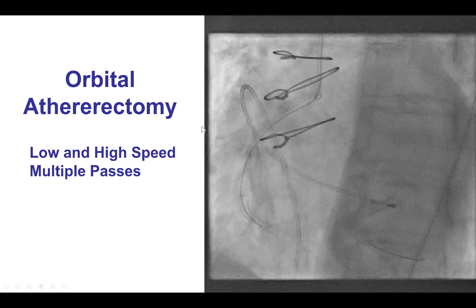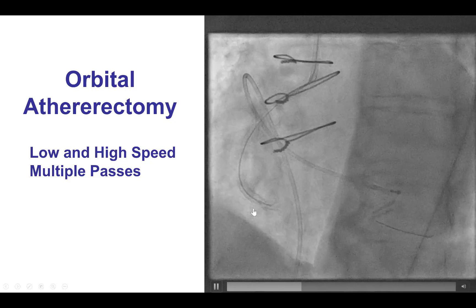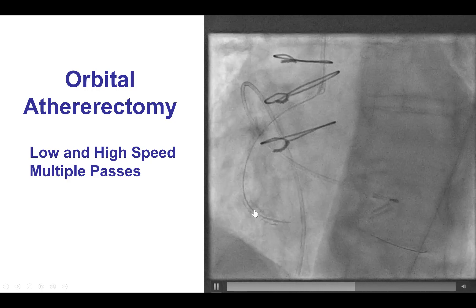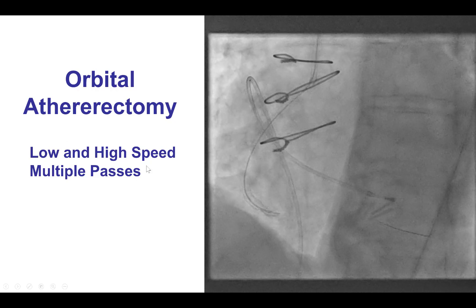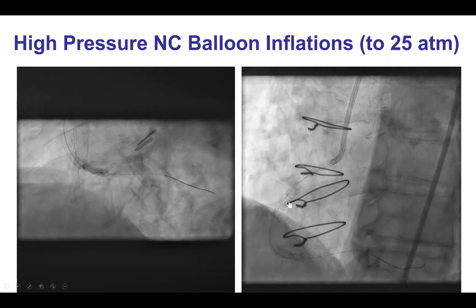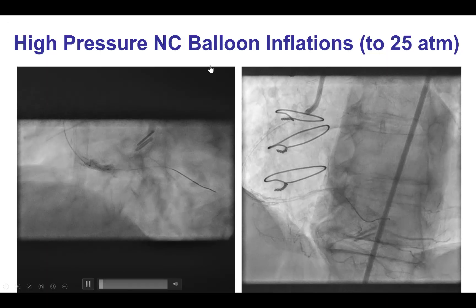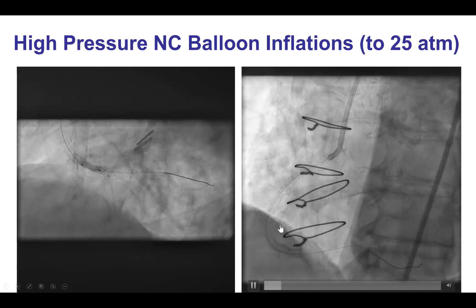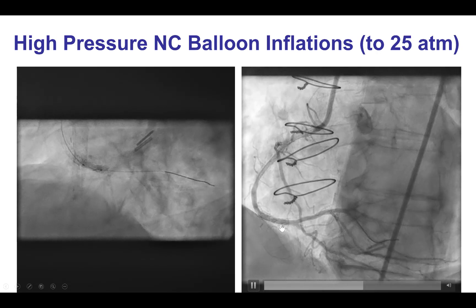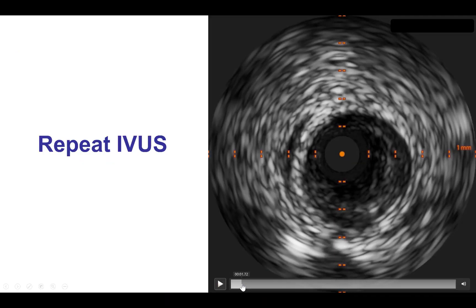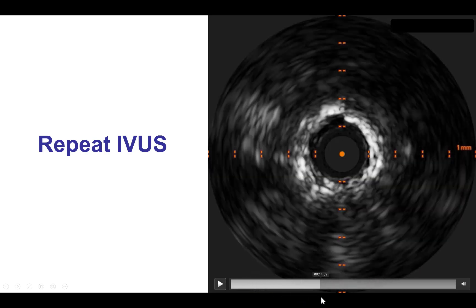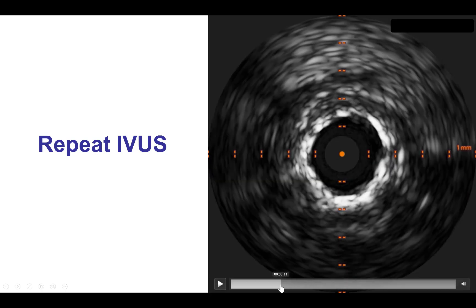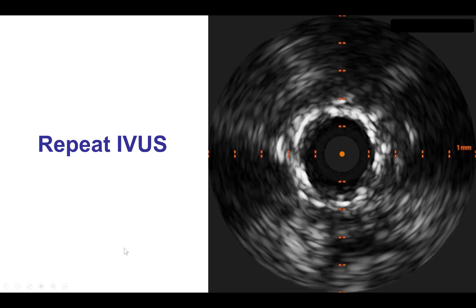A recent paper by Carl Alasved has shown that orbital atherectomy can be useful in such lesions with 95% success. We decided to use orbital atherectomy, performed at both low and high speed with multiple passes, followed by high-pressure balloon inflations. Angiographically, this looked much better, and for a moment we thought we had successfully expanded the lesion. But IVUS showed the area of under expansion was actually unchanged, although expansion was much better distally and proximally.